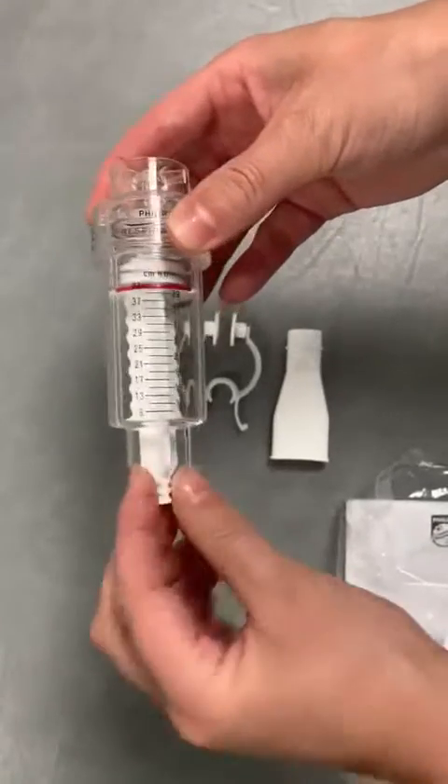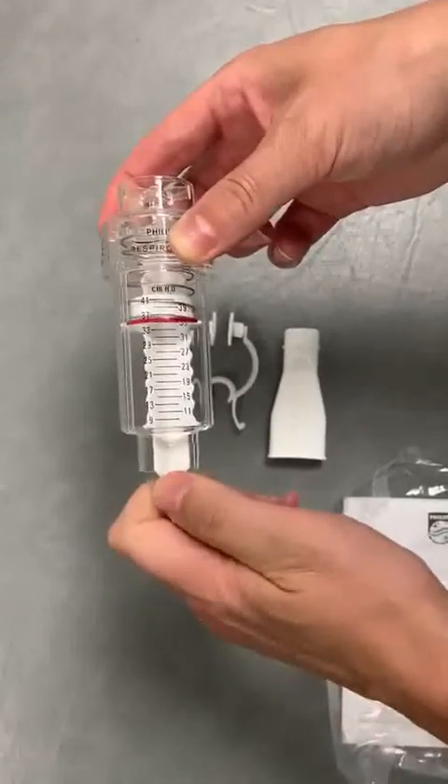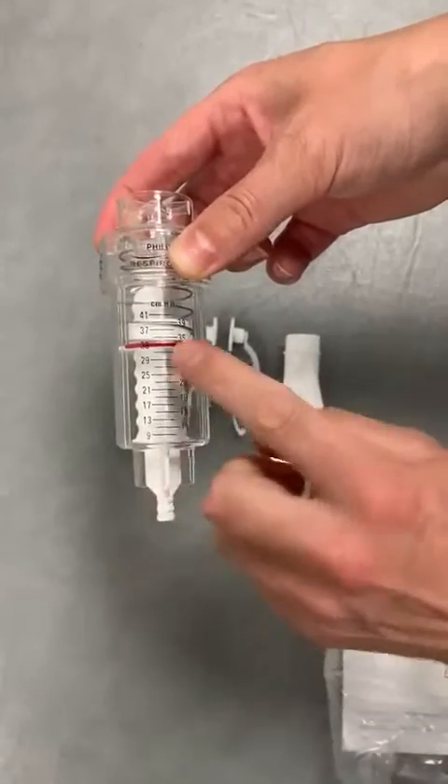To adjust it, you just turn the little dial at the bottom here until the red line marries up with the setting that you want it to be on.